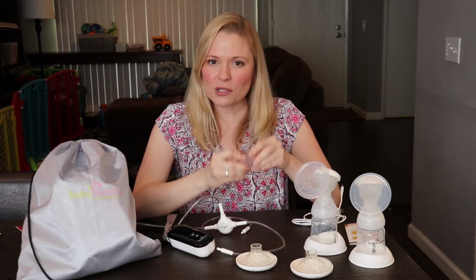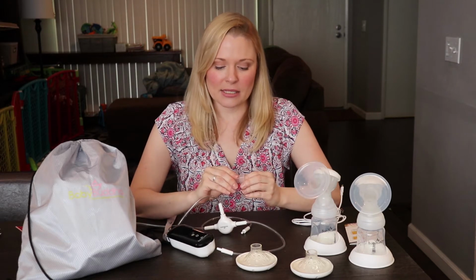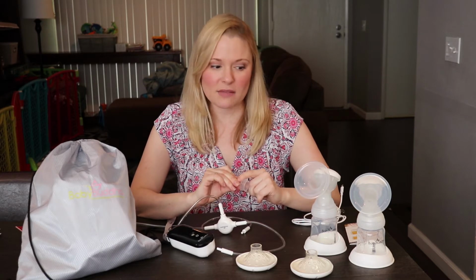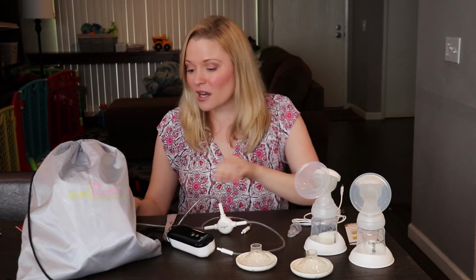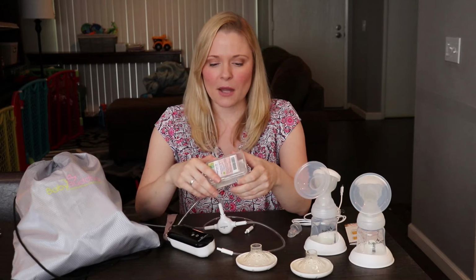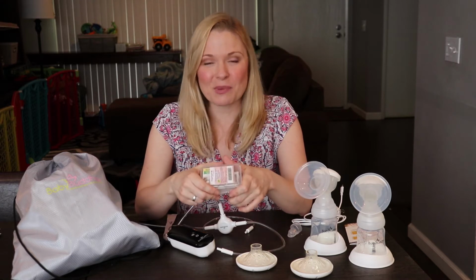Now, I also had a lot of problems with suction in general in the beginning, and eventually, I just got so tired of not only cleaning the valves and the membranes and not it having a great suction situation that I switched to the duck-billed valves. I just got these off of Amazon, but I also have a Spectra pump, so I knew that I could use these. And it kind of changed my life.